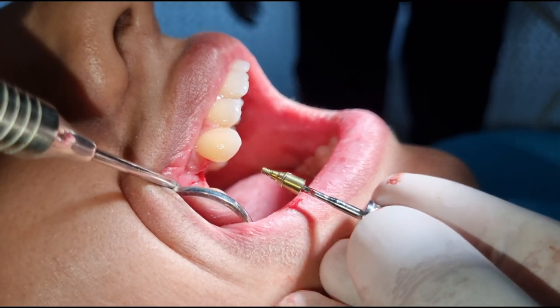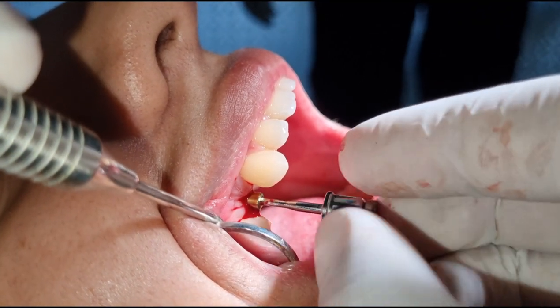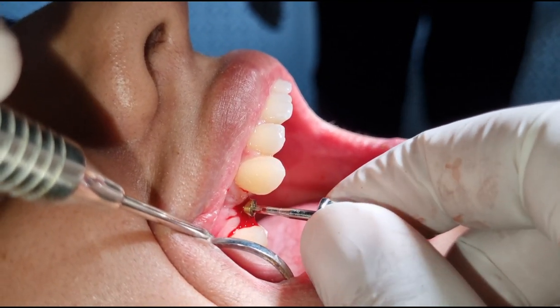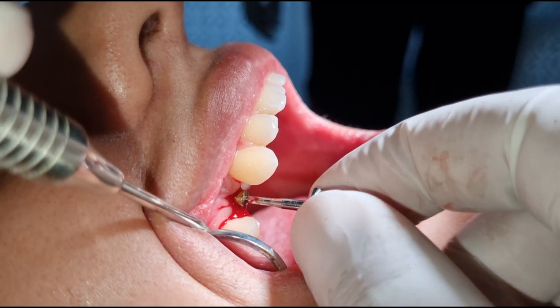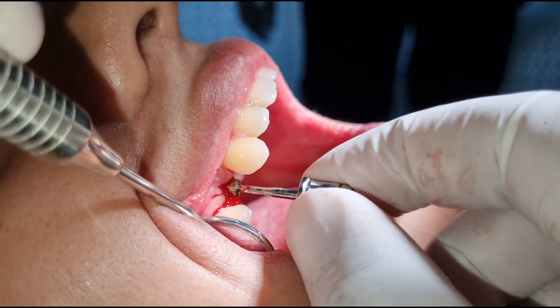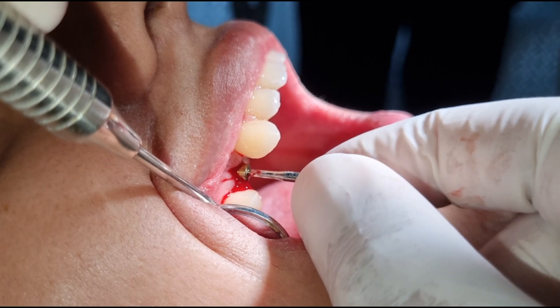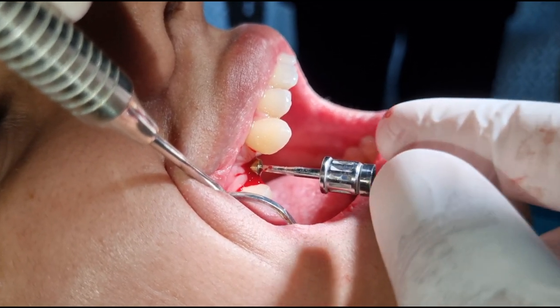Now I am going to place the healing abutment over the implant so that the soft tissue heals beautifully around it. You can see that the shape of the healing abutment is round, so there will be a good collar of soft tissue around it. You have to tighten it properly so that it does not get loosened during the two weeks of healing given to the patient, but not too tight that it cold welds to the implant. Firm finger pressure is sufficient to confirm it has been tightened properly.